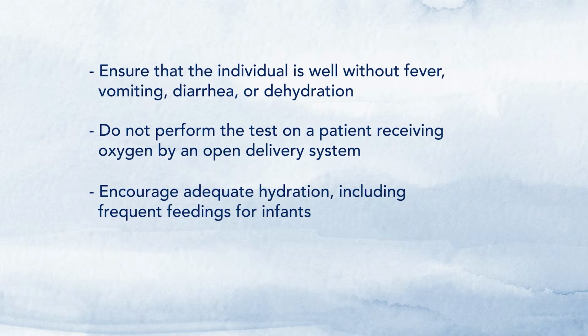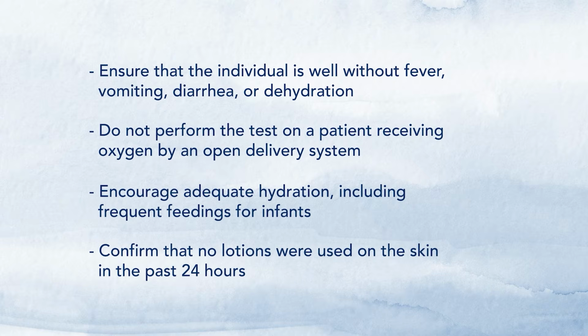Encourage adequate hydration, including frequent feedings for infants. Consider allowing infants and children to drink during the procedure. This can help with hydration and with distraction. And confirm that no lotions were used on the skin in the past 24 hours.